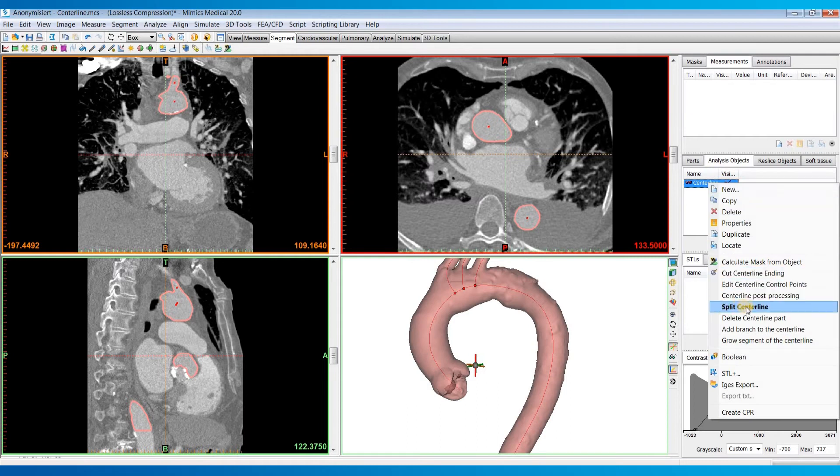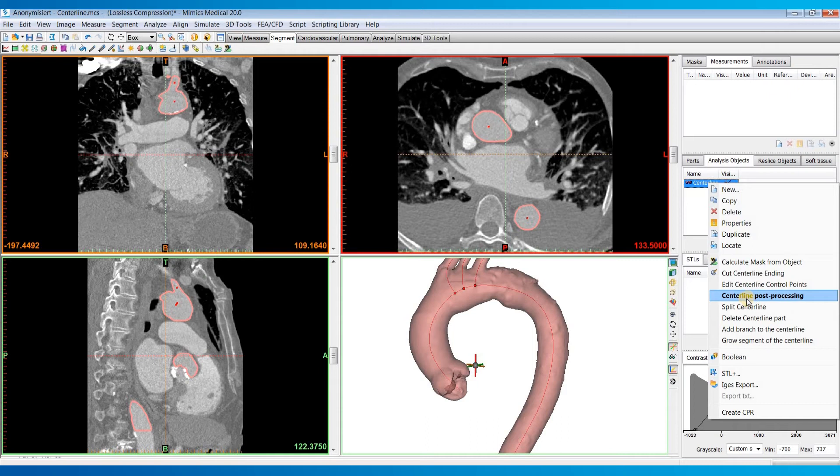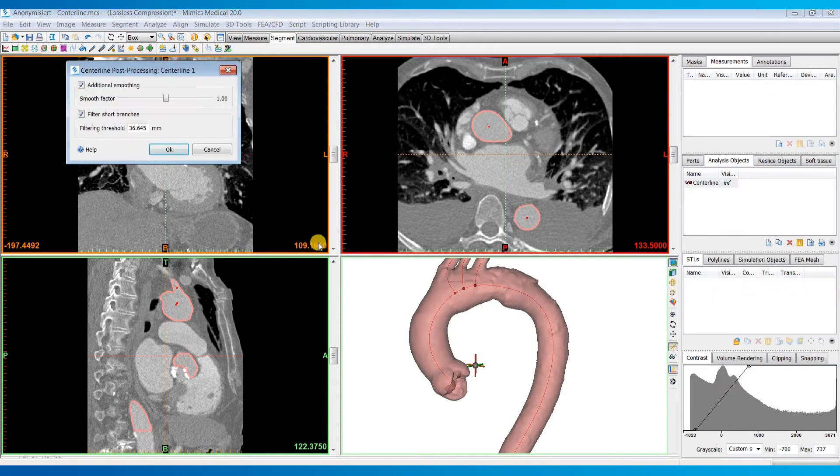You can also split the centerline if you wanted to split it into multiple segments. You could delete part of it. You could add a branch to the centerline. There's some centerline post-processing. So if it didn't quite come out smooth enough, you could do some additional smoothing or maybe filter out shorter branches.